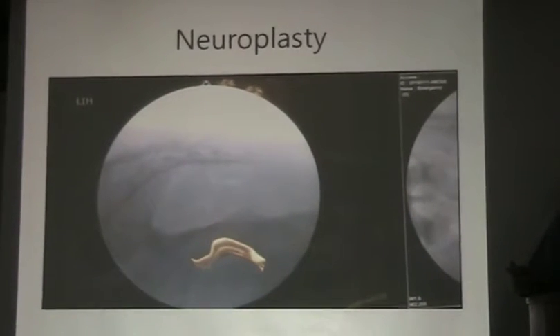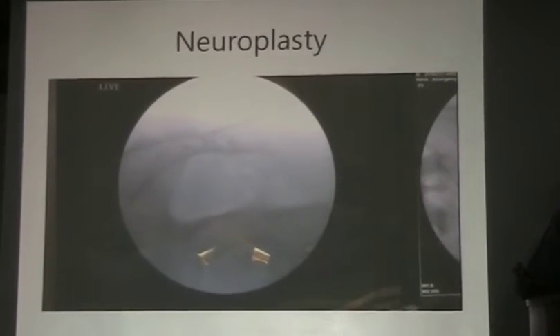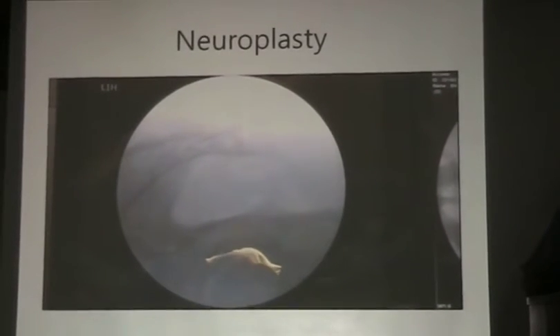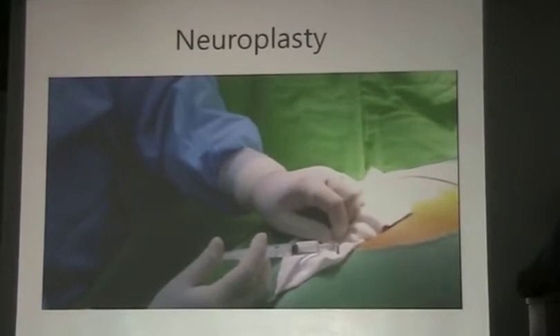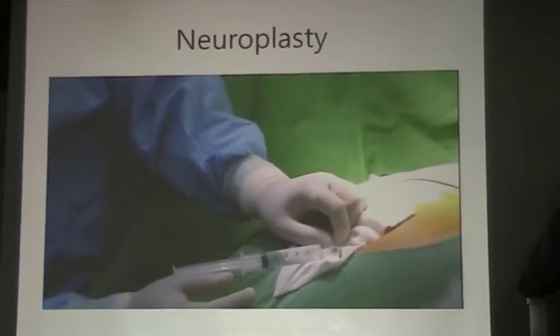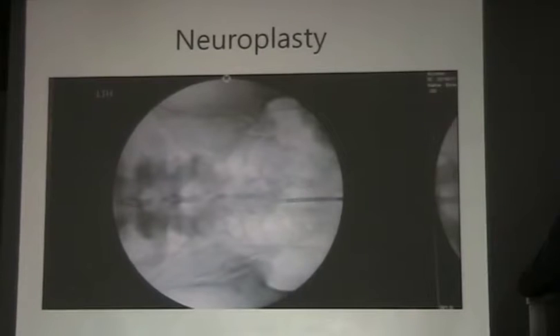Yes, making space and trocar insertion through the sacral hiatus gently. It is very important to parallel the sacral canal. And contrast media injection to confirm the sacral space. And the first solution to lubricate the sacral space for easy catheter insertion.